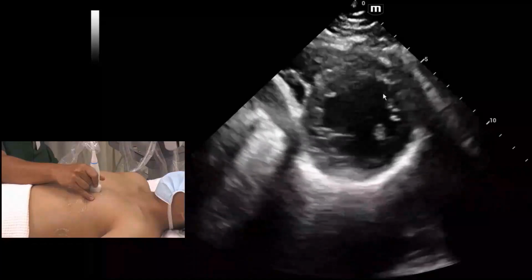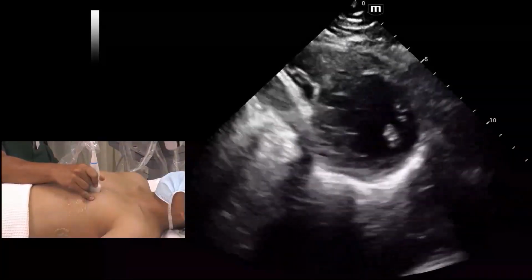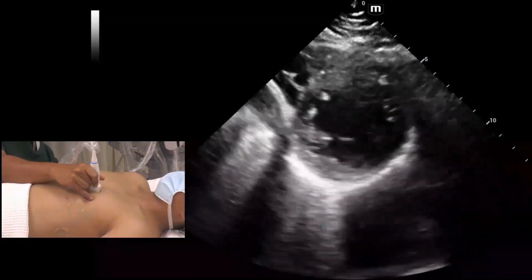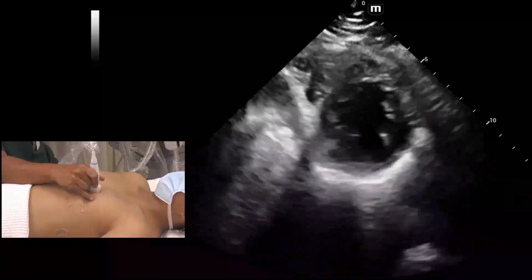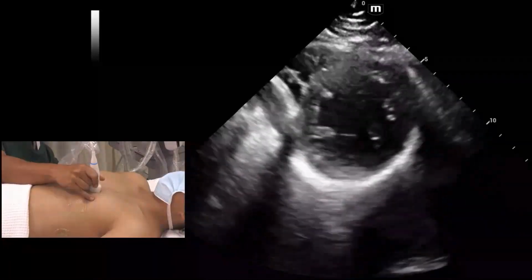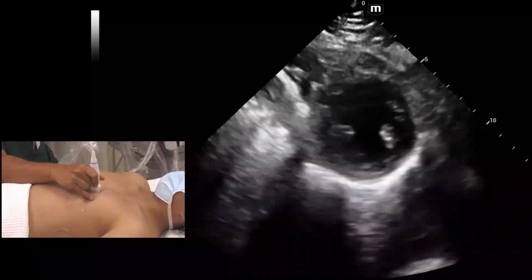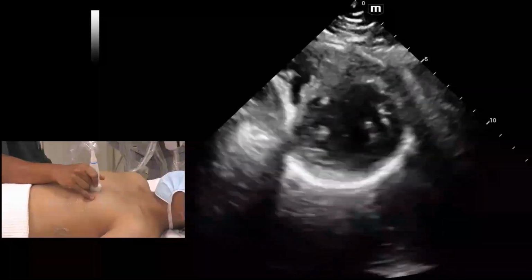Number two, if you look carefully at the segments, there is contraction in systole and diastole. If the thickness of each segment of the myocardium increases by more than 30% during systole compared to diastole, you know this is probably normal. Some people ask about EF.